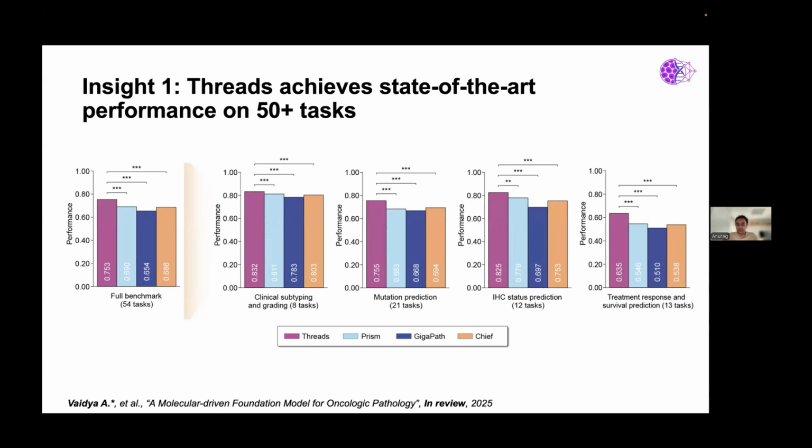But to give you an overview of how Chief pre-trained their model, and please correct me if I'm wrong over here, whatever organ or disease the slide belongs to, they created a language representation of that, and then they contrasted their slide representation with this language representation. Whereas Prism, on the other hand, took the entire clinical report belonging to this whole slide image and compressed it and then contrasted it. Does that make sense? Yeah, that's true.